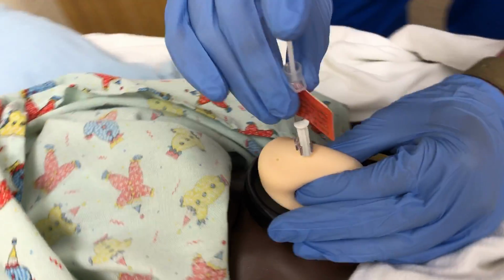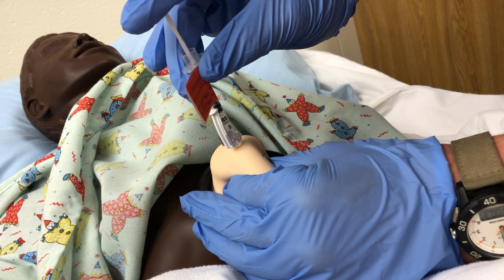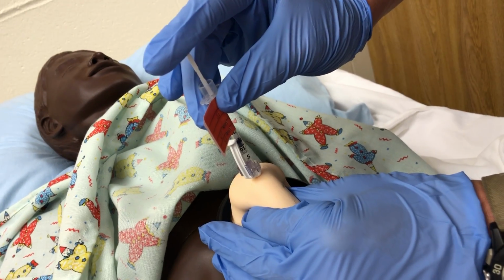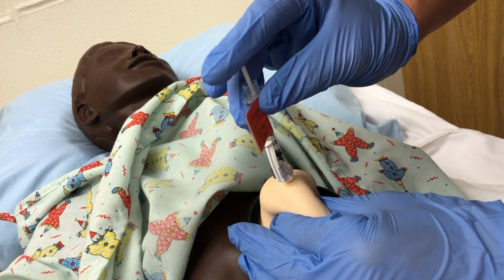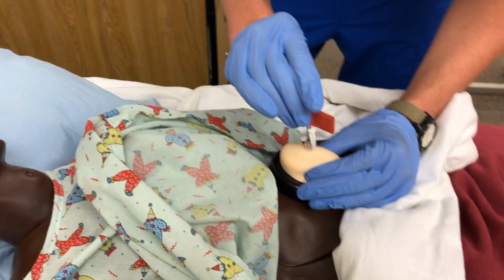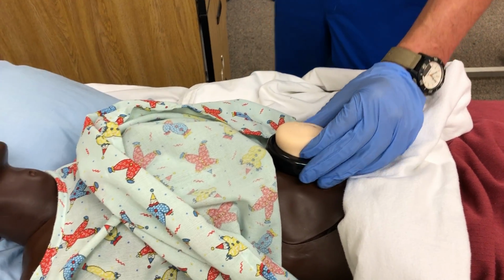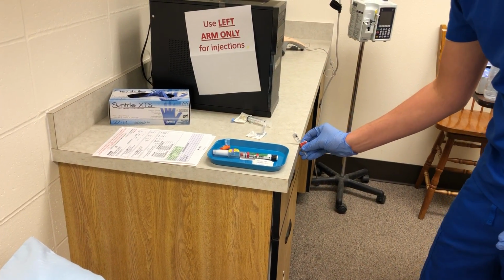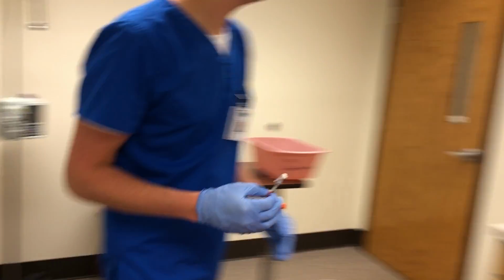And then we're just gonna slowly go in, making sure not to push too fast, because it can burn the patient. So we're just gonna make sure we're going at a nice, slow, even pace. Okay, so that's done, and we can pull it out. We won't rub it, and then I will use the safety on an inanimate object. And so that's clicked and ready. So I'll grab the top and take it over to the sharps.